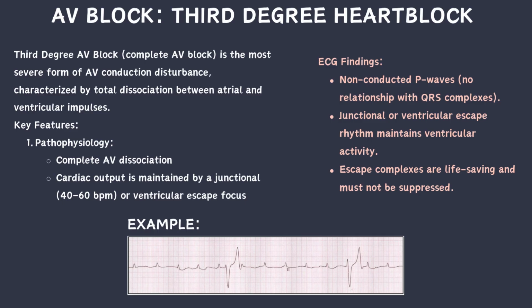Lastly, we have AV block, third degree heart block. Third degree AV block, or better known as complete AV block, is the most severe form of AV conduction disturbance, characterized by total dissociation between atrial and ventricular impulses.